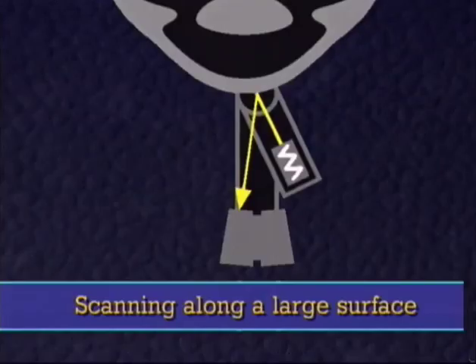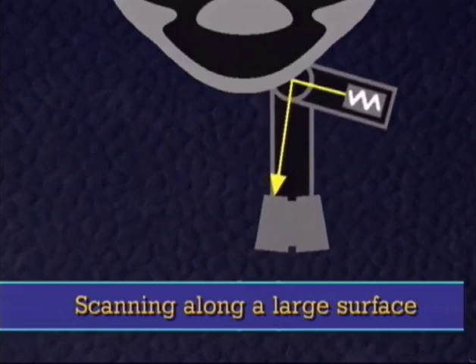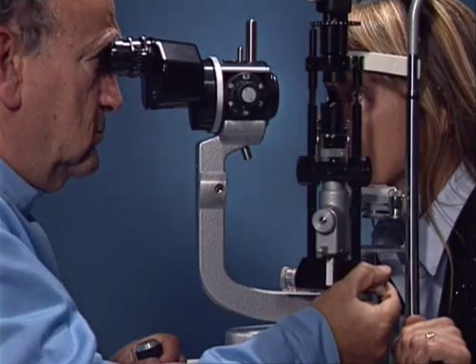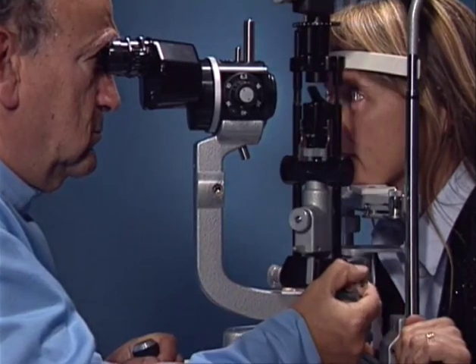For scanning along a large convex surface with the microscope in a fixed direction, the illumination unit must be rotated in the direction of the scanning movement, that is, when moving from the left to the right, rotated to the right. In contrast, when scanning from the right to the left, the illumination unit must be rotated towards the left. Thus, the scanning movement of the slit lamp is combined with a rotation of the slit beam in the same direction.